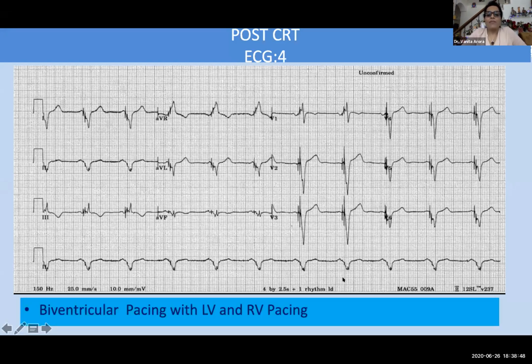So it is a true BiV pacing. If you look at lead V1, it is positive, or I can say it is biphasic, and lead 1 is negative. And we have a narrowing of the QRS to about 100 milliseconds. So it is a very beautiful BiV pacing that is there. You can play around with the notch as we just discussed. With the sync AV, you can play around with the notch to have this notch eliminated from the center of the QRS or the QRS distally.